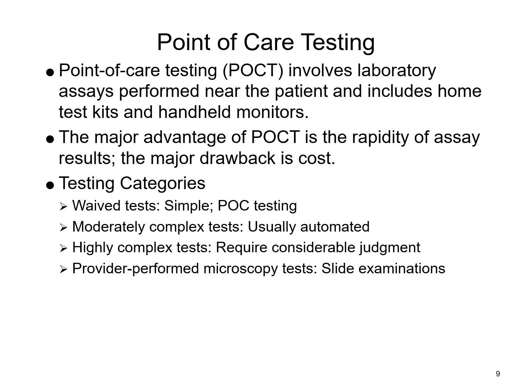Now, within the laboratory, CLIA has established that tests fit into 4 categories, to include waived testing. These are simple tests that are very simple to do, with little chance of any negative outcome if they're performed inaccurately. Examples of this include your point of care tests.